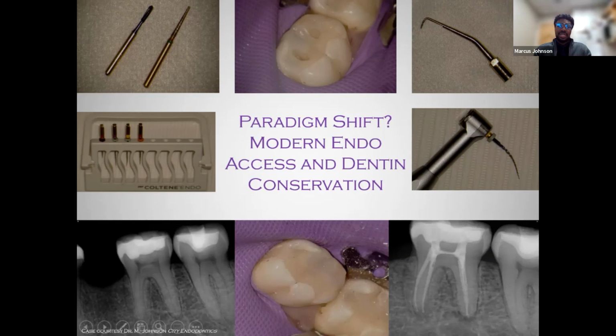General dentist had recently done a nice restorative, occlusal restoration. Patient became symptomatic relatively soon after. You can see that they are missing some occlusion mesially. And so I was thinking, this is a very wide pulp chamber. What's the best way that I can conserve dentin and still address this patient's chief complaint?